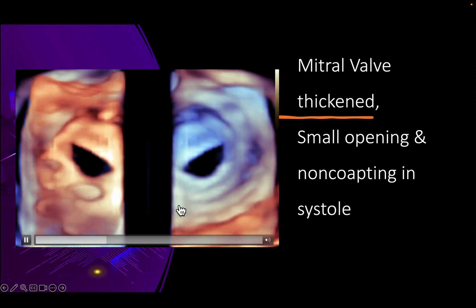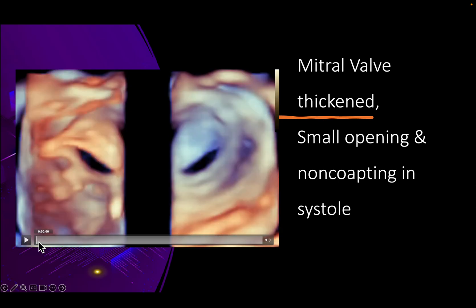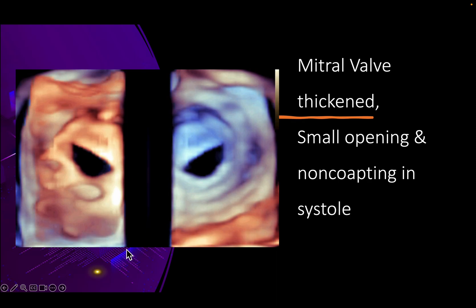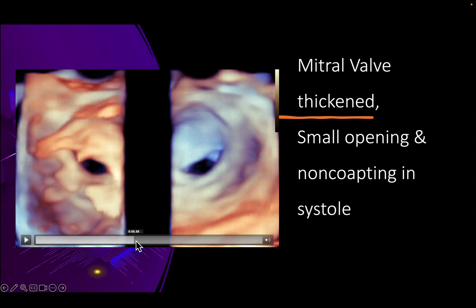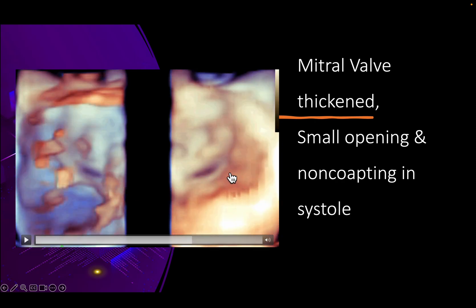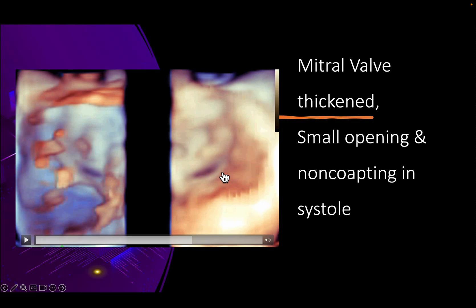To wrap up, here is a 3D echo en face view of the mitral valve. You can see the mitral valve opening and the mitral valve area. This is the ventricular side, this is the atrial side, and the valve does not coapt fully even at end systole, leaving a gap from where the regurgitation was present.